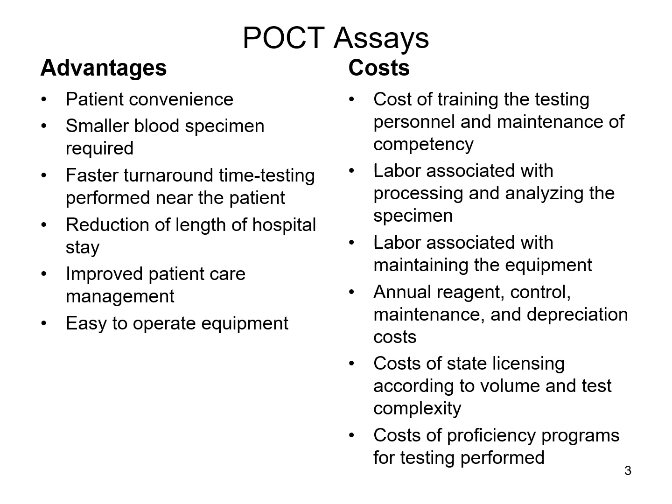And this is just that report card check where you get samples with unknown values that are known to the company, but they're unknown to you, and you run them just like a patient, send in those results, and essentially you get a report card back that compares you to what other laboratories get for those results, as well as how close you are to what the known value was.